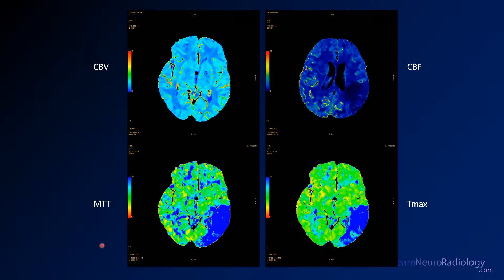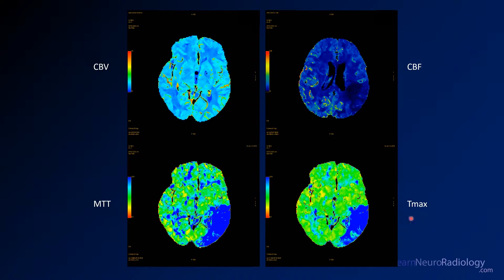Now the patient is going to go on to get CT perfusion. Here I've shown you the perfusion maps through the central brain. In the top left corner you have the CBV or cerebral blood volume. Top right you have the cerebral blood flow. Bottom left you have the MTT or mean transit time. Bottom right you have the T max.